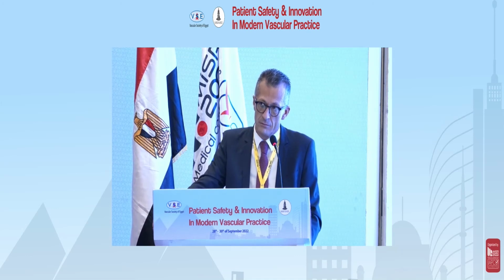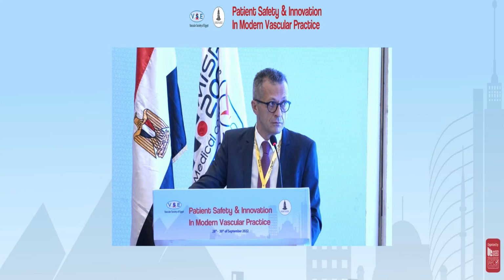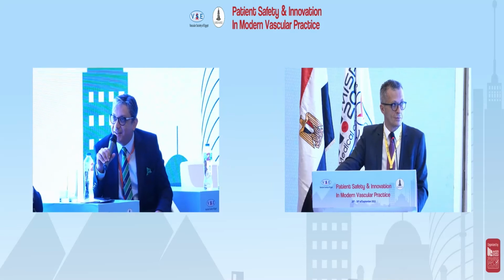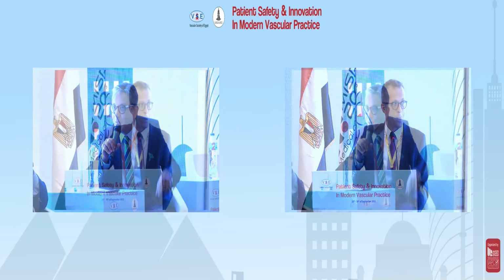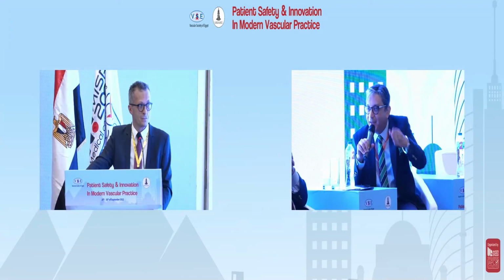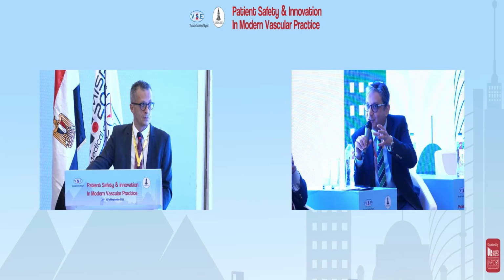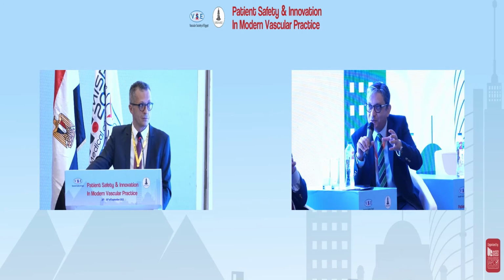Yeah, I think Dr. Bruno here is introducing maybe a new technique, using the Rotarex, instead of having a femoral access, to have a subclavian access and put a long sheath and go from up down. It will be safer, and with the bloodstream. This is a modulation of the technique. Is this possible and feasible to do?